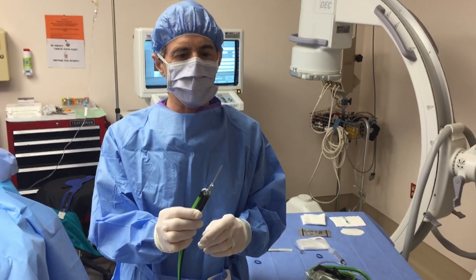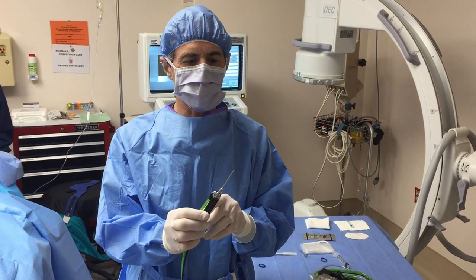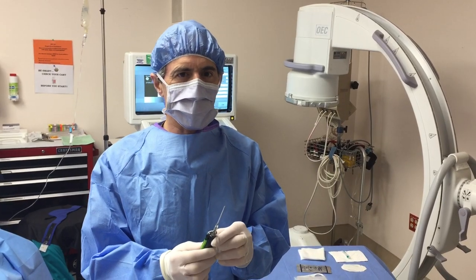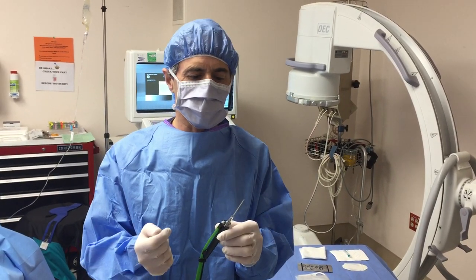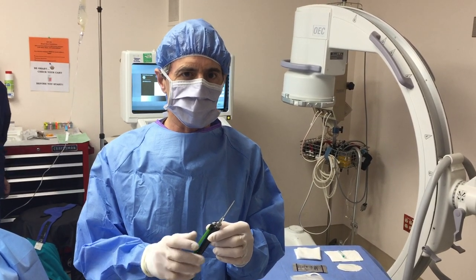So this is the 10x microtip. This is the device we use for the procedure. It uses ultrasonic energy to treat the tendon, to remove any scar tissue which may exist and induce healing.